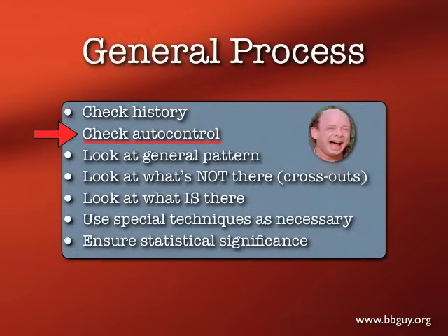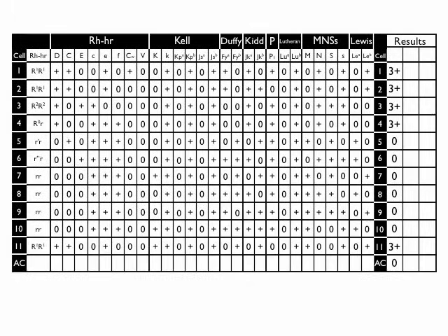All right, so moving along, after we've checked the history, the first thing that I always do, every single panel I look at, is I check the autocontrol. The autocontrol being positive changes the entire approach to the panel. Now here's a panel that we're going to beat on for a little while here.